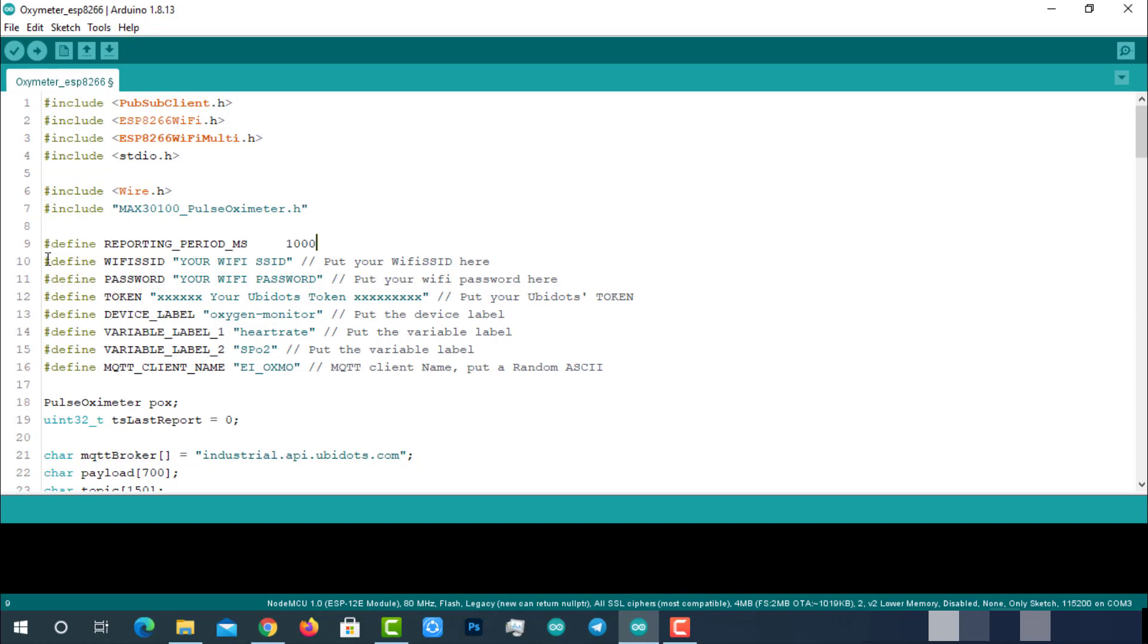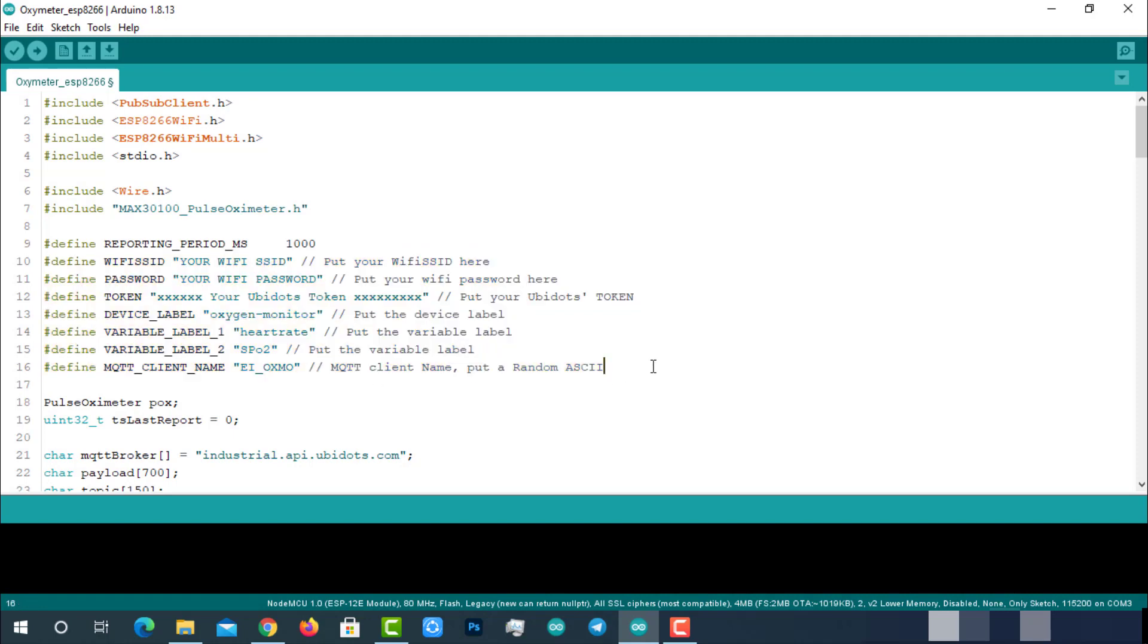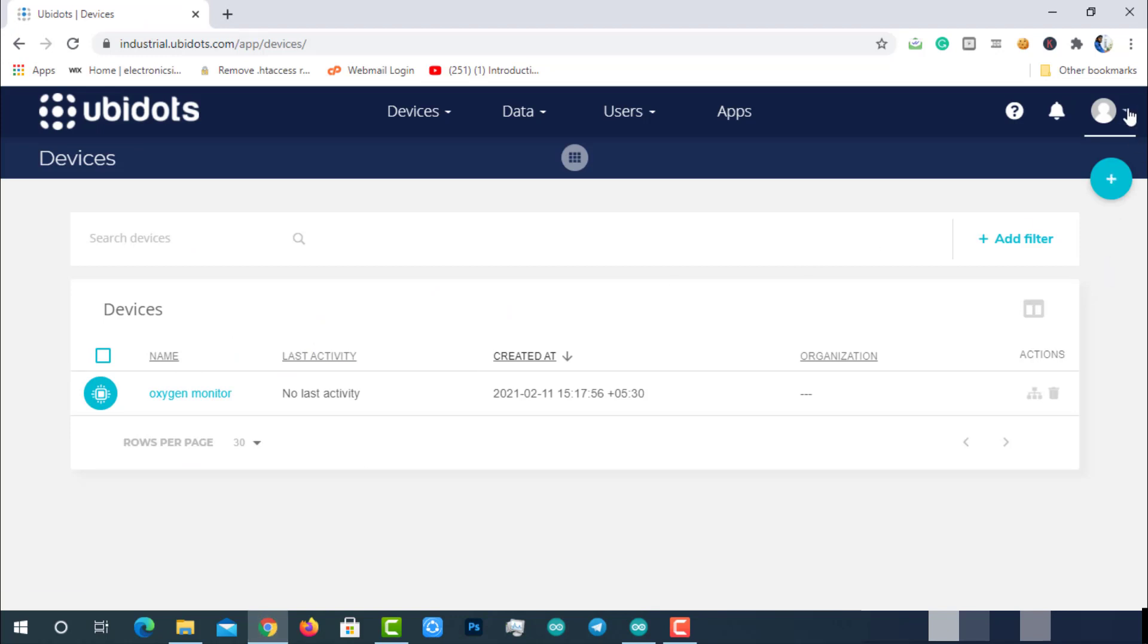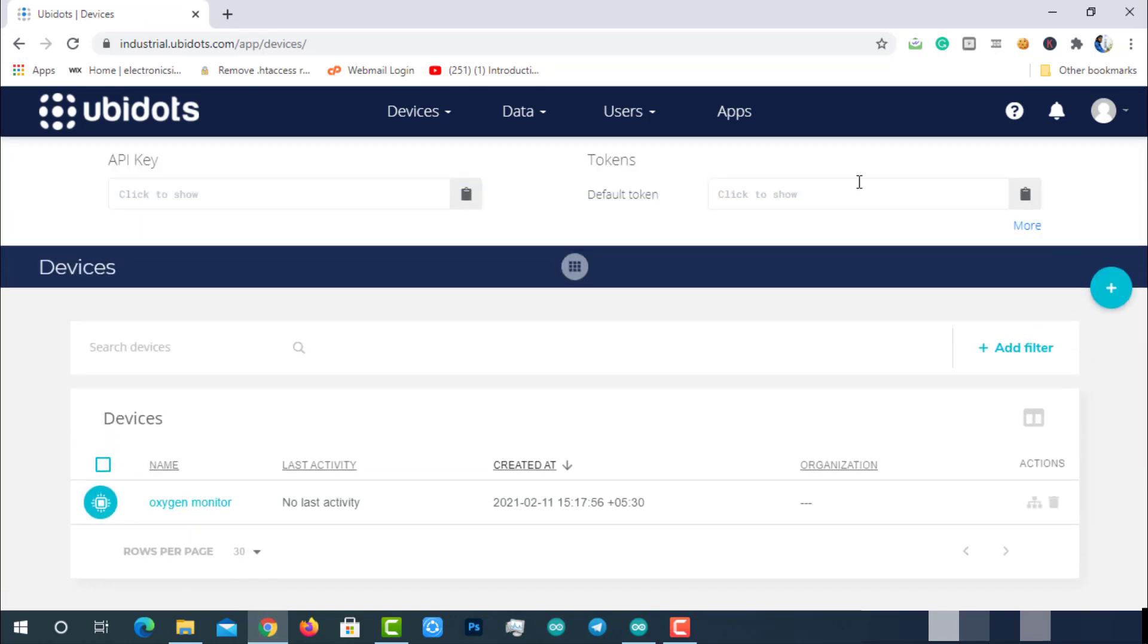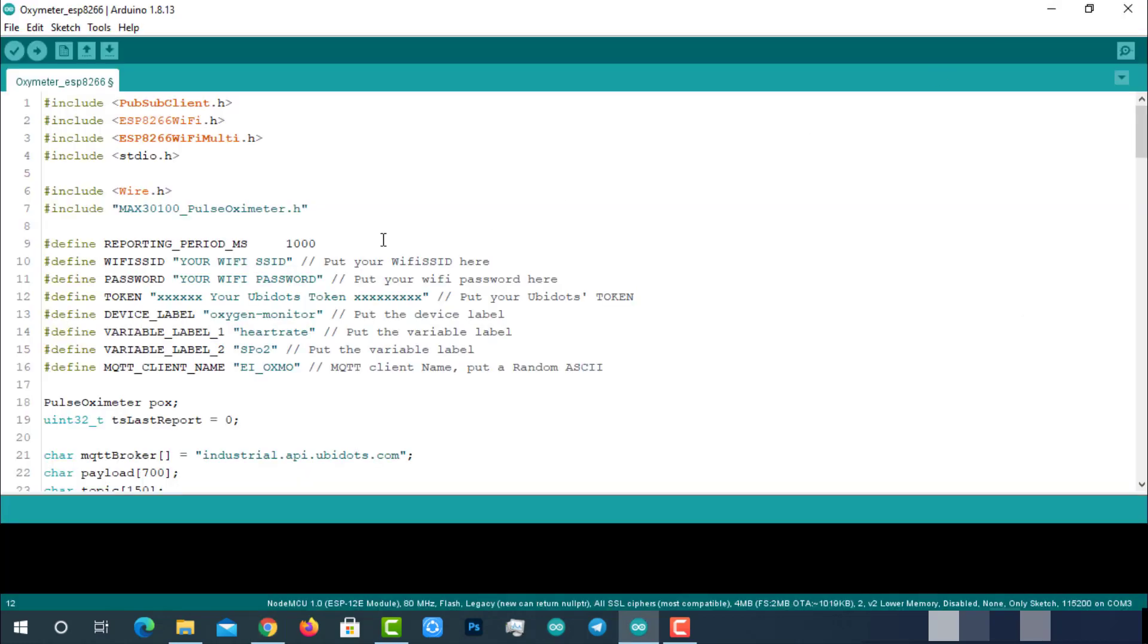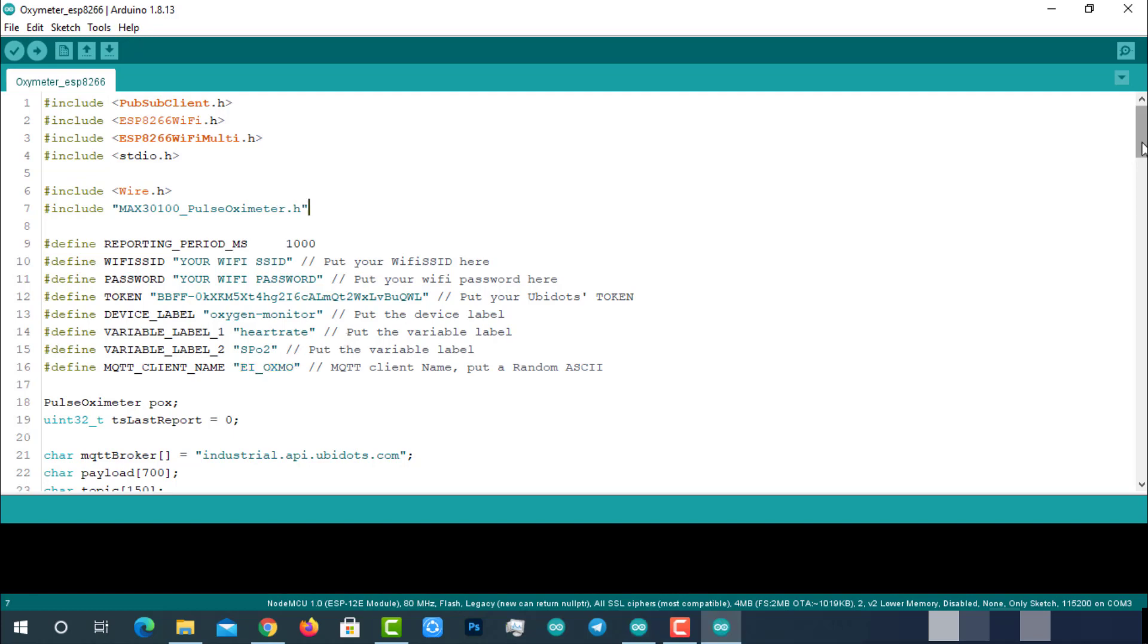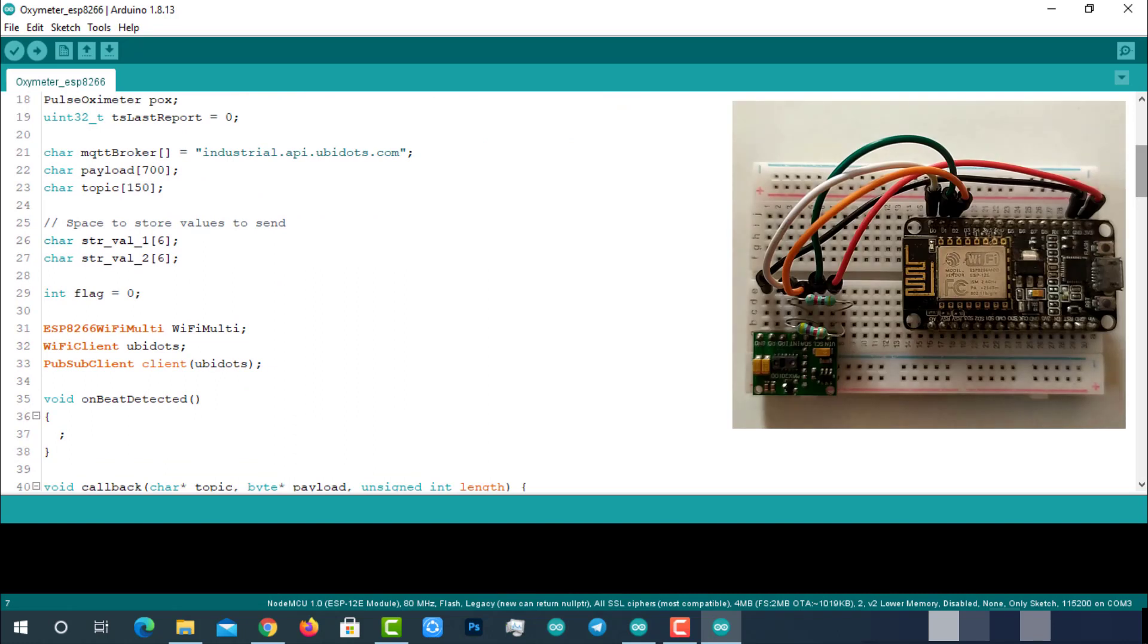Provide Wi-Fi SSID and password for internet connection, then provide the Ubidots token. We can get this from Ubidots itself - go to API credentials, copy this token, and paste it over here. Then enter the device label which we created on Ubidots earlier. Now enter the variable labels and MQTT client name as you wish, or you can leave them the same because that doesn't make any difference. Now this code is ready to upload to the ESP8266 module.